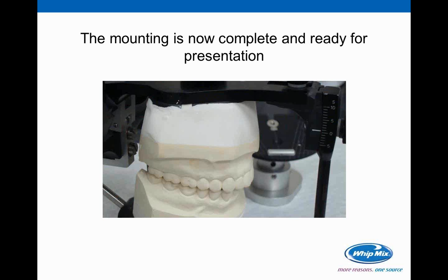You're as accurate as you possibly can be in an arbitrary world. And you're consistent, which sounds funny, but you're consistently arbitrary or arbitrarily consistent. One of those two things. But at least your cases are mounted the same way each and every time. You're not going to have that lack of consistency coming to a larger frame articulator, like you do if you're just making a guess, or if you're using the rubber band method, or if you're using the modeling clay method.